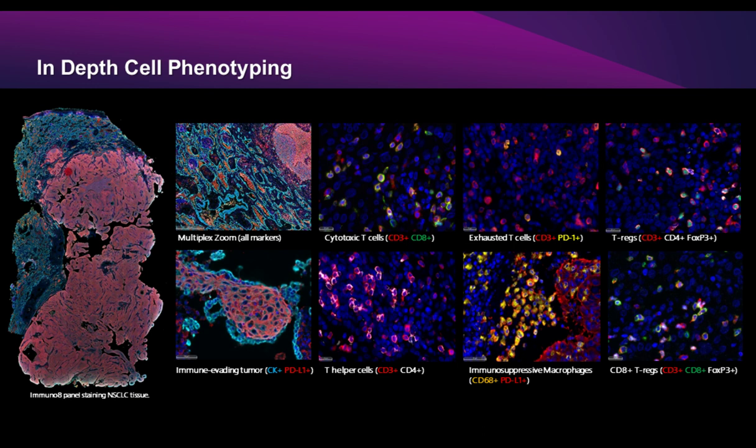So I could just talk from our experience. We did take a really quick look, or a close look, at multispectral imaging and, of course, technology. There's a lot of good things about multispectral imaging, but one challenge with it is that it's very sensitive to the expression of each marker and its proximity to each other. One marker can easily overbalance another marker, and it makes it tough to balance. So there's a lot of optimization that needs to be done.